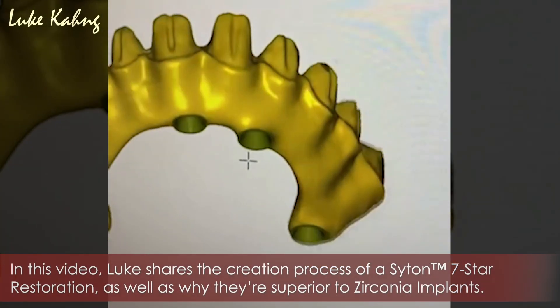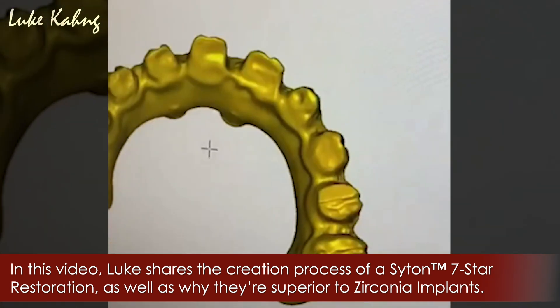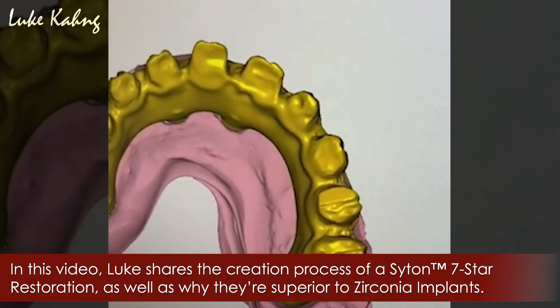Another seven-star case for Dr. Eric Wong. It's a multi-unit lingual.